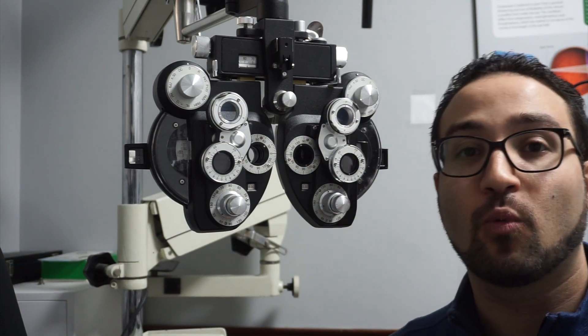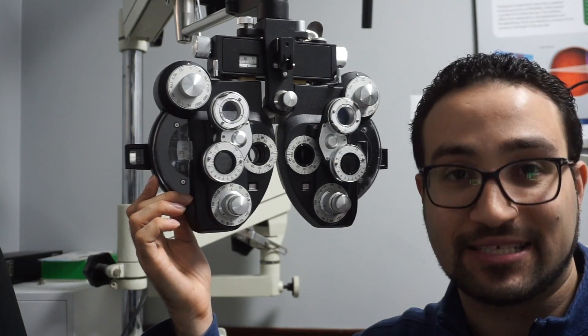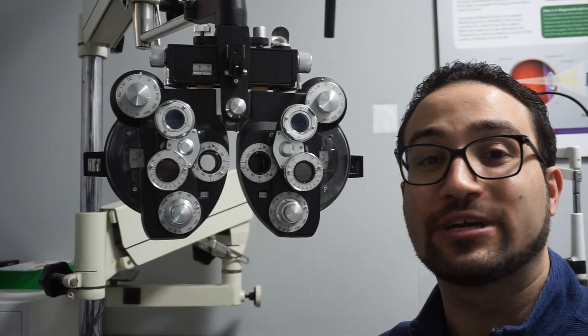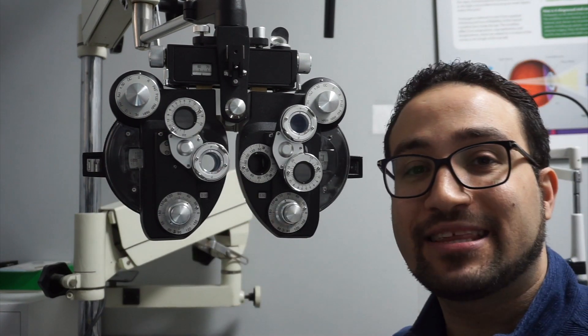Once they reach the point where option one or two feels quite the same, we know we've reached our neutral point — any more and we'll begin to over-minus the patient. Now it's time to check for astigmatism.